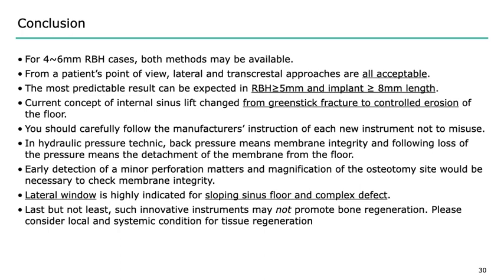Lateral window is highly indicated for sloping sinus floor and complex defect cases. So with the advancement of the recent newly developed transcrestal approach instrument, you can still have a chance for a transcrestal approach even in sloping sinus floor, but you should be able to do lateral window technique for the patient.